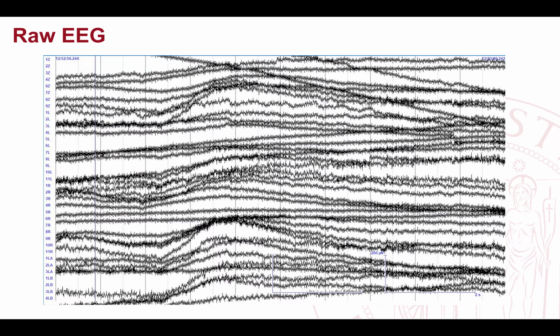And then we also have these high amplitude, low frequency waves, which are normally not very informative. It is not very easy to extract any information at all.